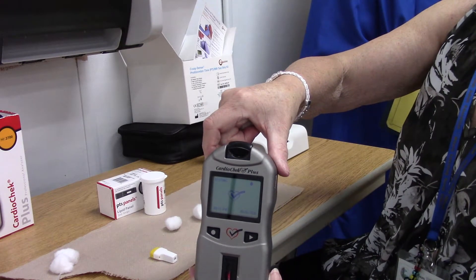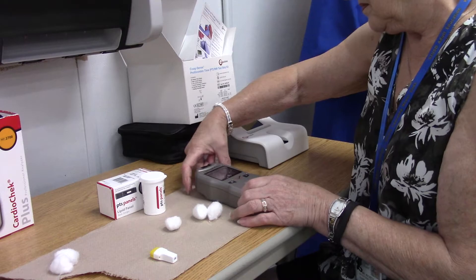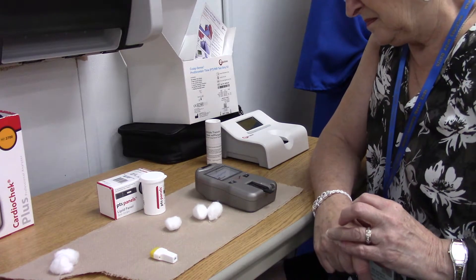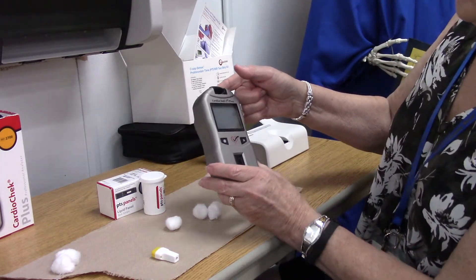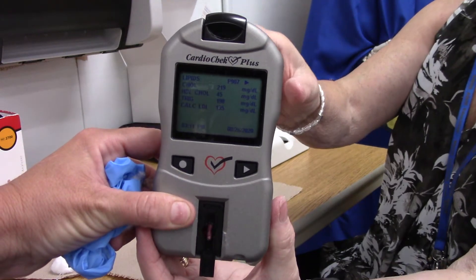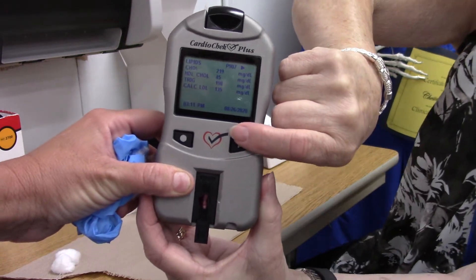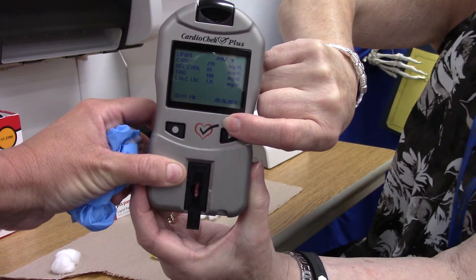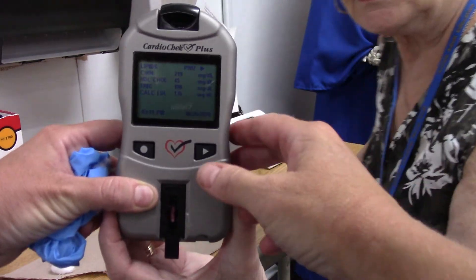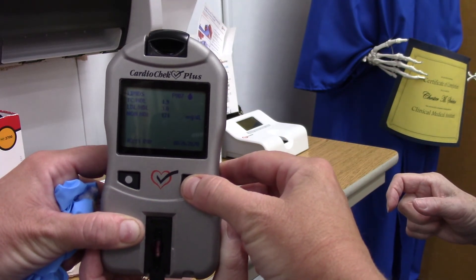Angle the finger down — that's what you'll be seeing. The machine will give you your results. When the results pop up, write them all down with your labels. There are multiple sets of results, so make sure you capture all of them.